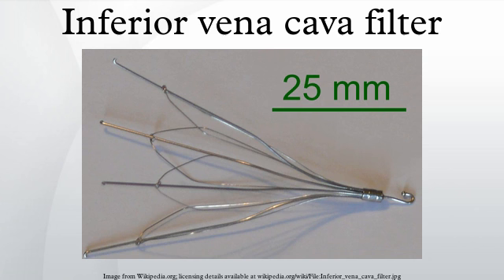most radiologists object to doing prophylactic filter insertions in patients who do not have thromboembolic diseases. For the most part, whenever possible, interventional radiologists would rather start the patient on anticoagulants than use an IVC filter, even if requested or referred via a doctor.